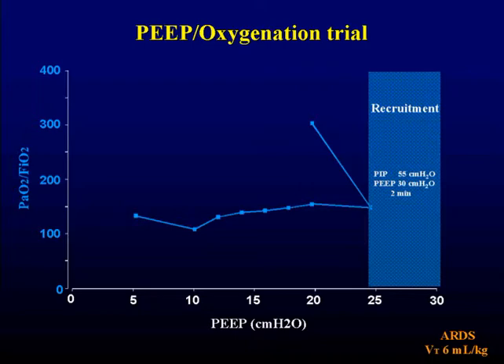And then we started to titrate our PEEP level in a descending way, in 2 centimeter steps: 18, 16, 14, until 12, where we saw that our oxygenation was again decreasing, a clear indicator that we went too far low with PEEP and that our lung was starting to collapse.